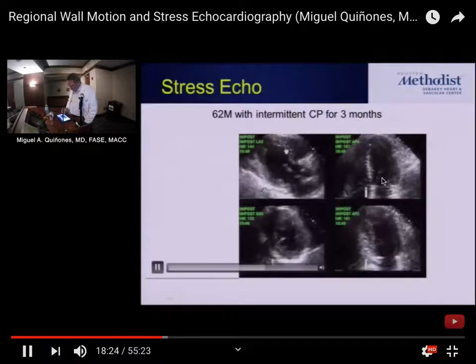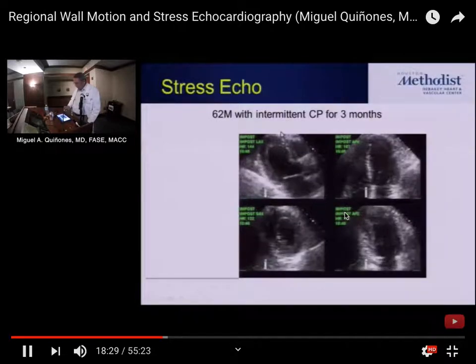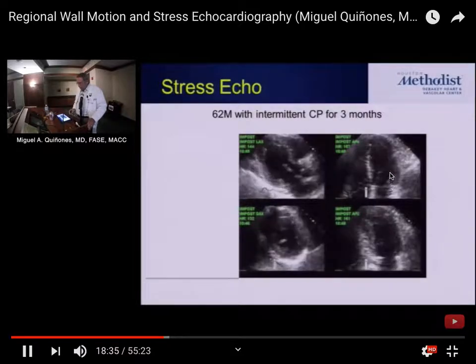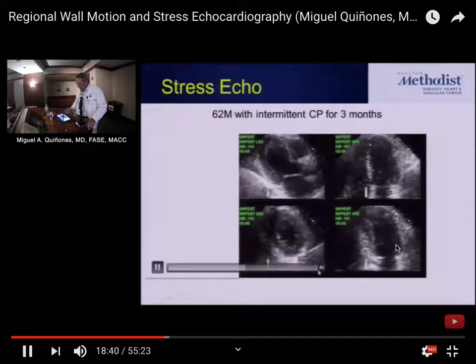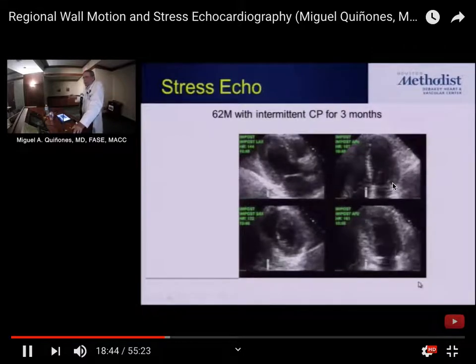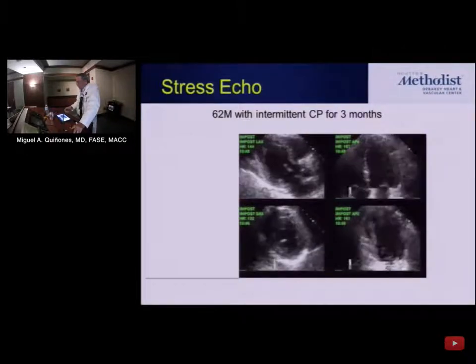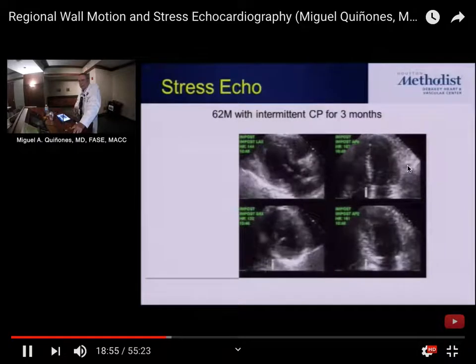So these are the same view, all right? Both of these look like they're post-stress, right? And you have to ask the question, is this heart contracting normally? Right? And you can see why it's a little tricky. It's the sort of signal to noise of the system for making this call isn't the best.